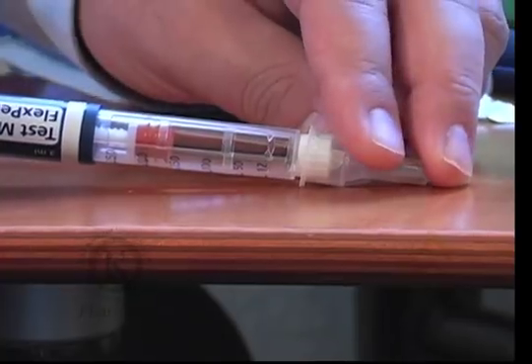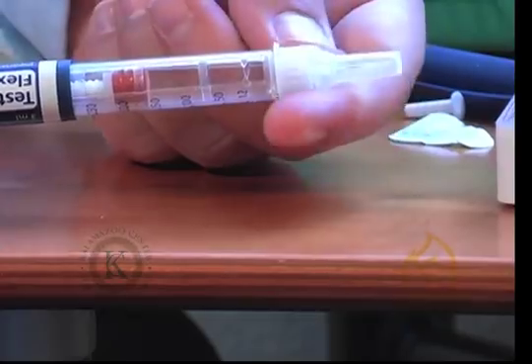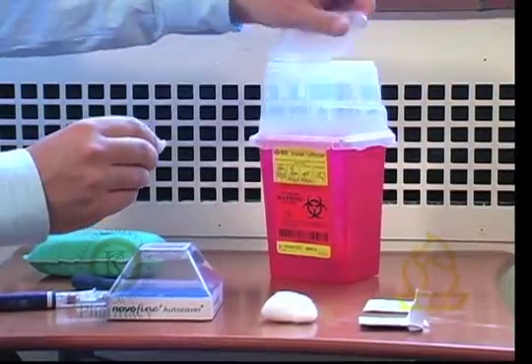Recap the needle as shown and then unscrew it from the device. Dispose of the needle in a sharps container.